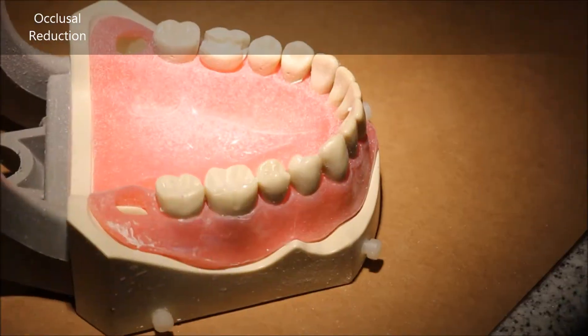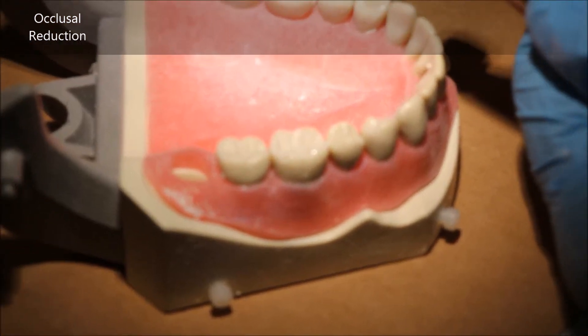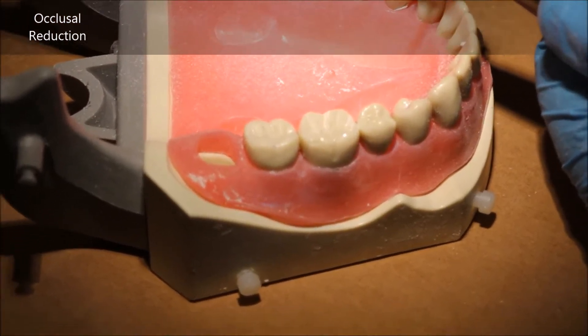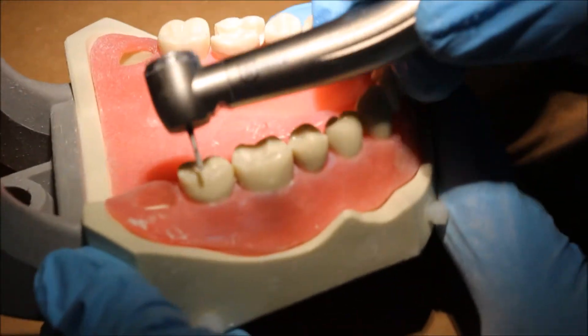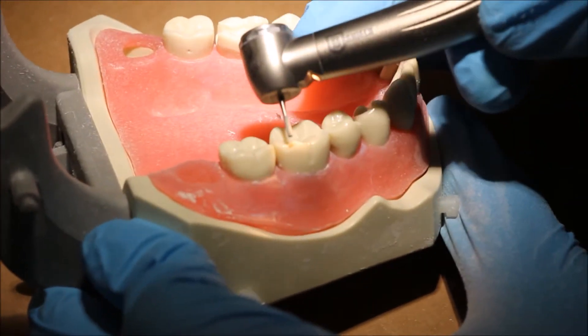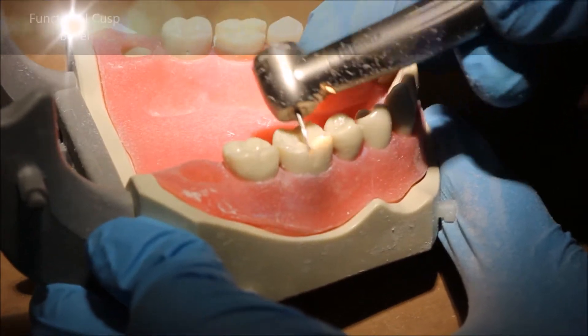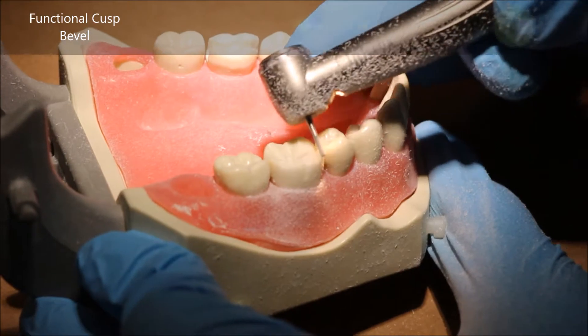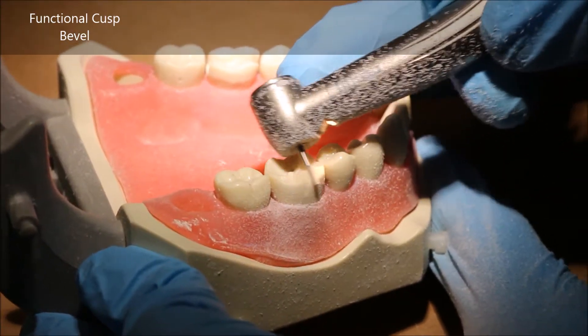If you use the 57, your initial occlusal reduction will leave you room to go back and touch up the occlusal reduction and ensure that it is one and a half millimeters, or smooth out certain areas or make small changes here and there.